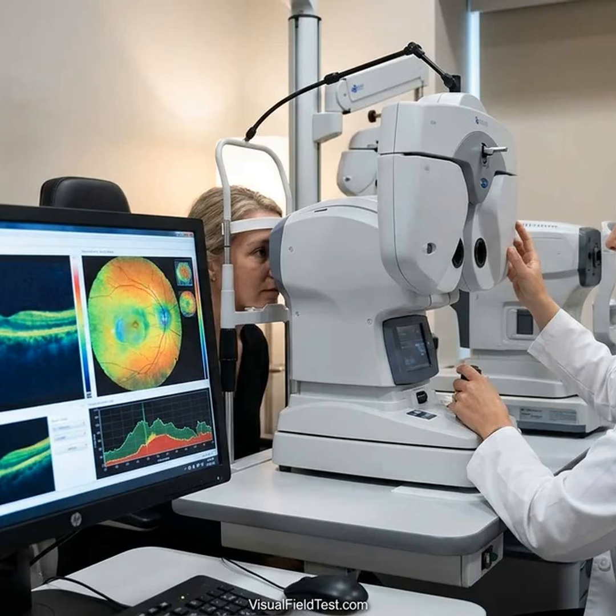Intraocular pressure, IOP. High eye pressure is a major risk factor. If OCT suggests progression, for example, a drop in RNFL thickness, and the pressure is above the target level, the doctor is likely to treat more aggressively. Conversely, if OCT looks abnormal but IOP is always very low and the field is stable, the doctor may attribute the OCT finding to something else. Risk factors and clinical context. These include family history of glaucoma, eye injury, heart disease, or use of steroids, as well as demographic factors.